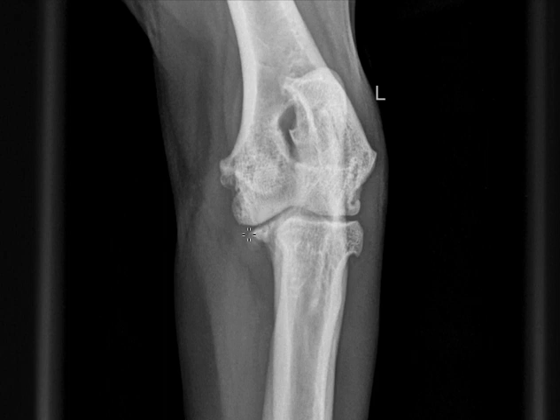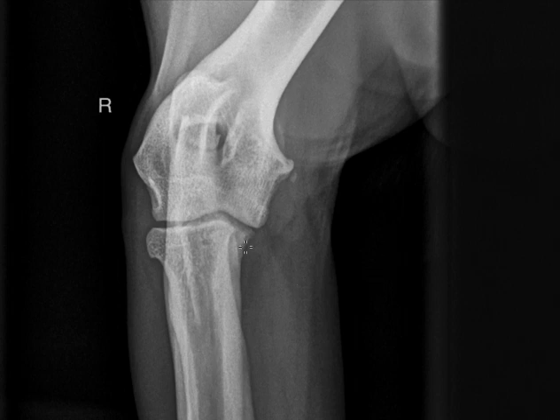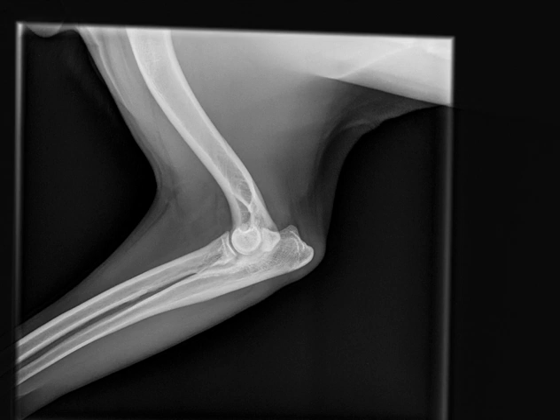Now, going back to your attention to the medial coronoid process, let's compare to the other side. On the right side, the medial coronoid process I'm tracing here is better defined. You can see that there's no fissure or fragmentation and that there's substantially less remodeling of the elbow joint. I do, however, see a small calcified feature adjacent to the medial epicondyle, as well as minor non-uniformity of the medial coronoid process. Let's shift our attention to the lateral views.